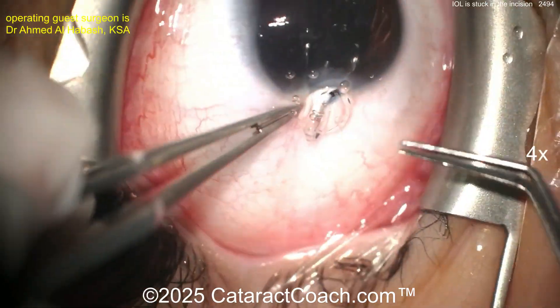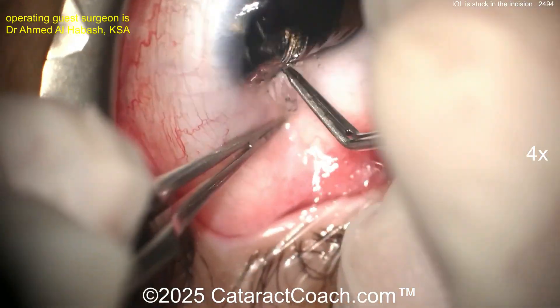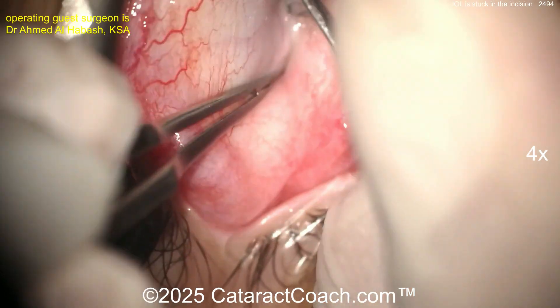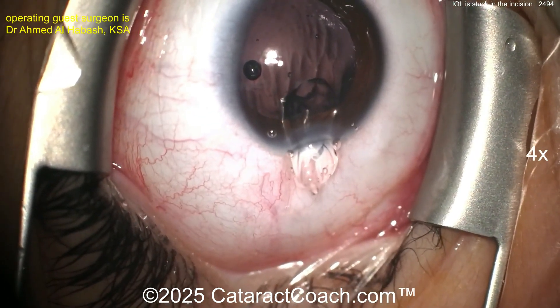At this point I'd pull it out — pull it out, pull it out. Oh boy, this is going to be a challenge. Think about what you're going to do here. We've all been in these tough cases. We're here to learn together. Let's look at this carefully. Now the problem is the eye is a little hypotonus — it's even harder to put the IOL in there.